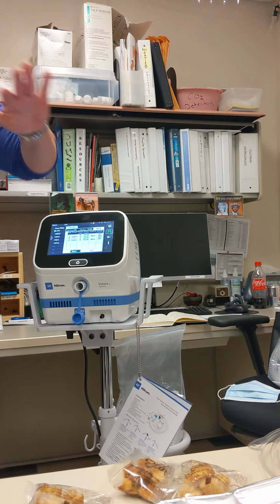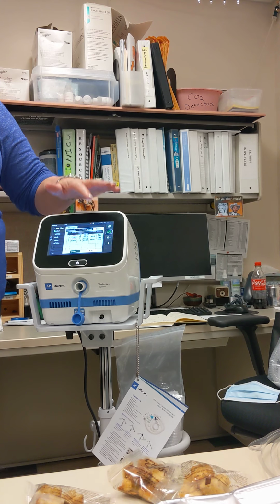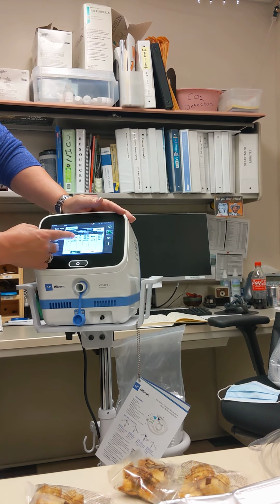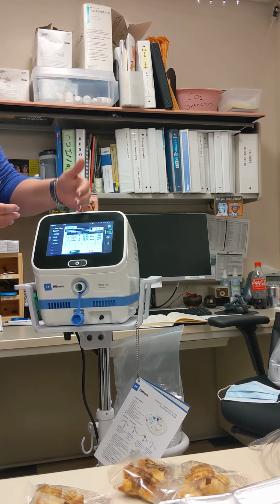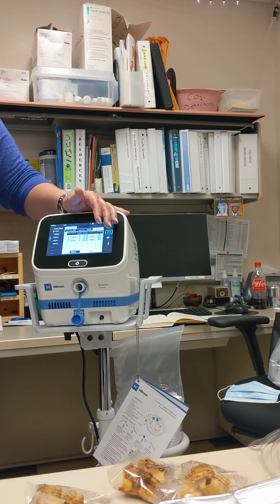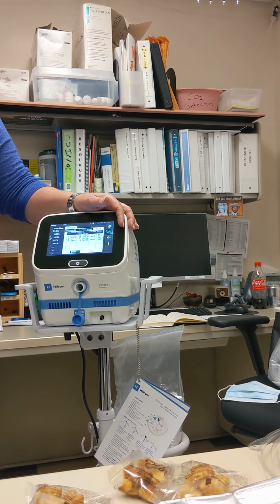We usually don't do automatic in a hospital setting unless you're so busy that nursing is doing the treatment. Otherwise, your guy is gonna stick in manual mode. You can do it, but when you set it up, you set up your pressures, whether you want the neb or not, your peak and how much time. You have to do it individually.